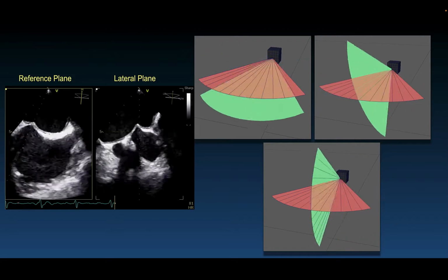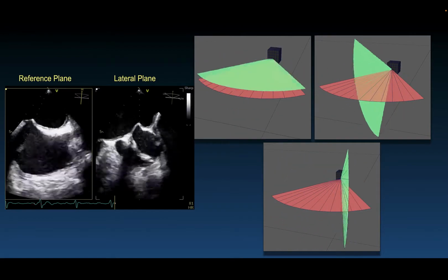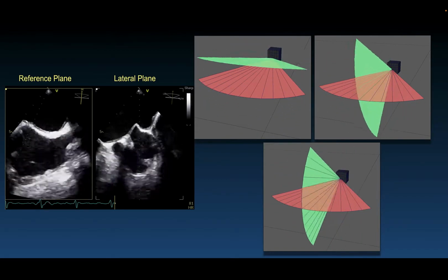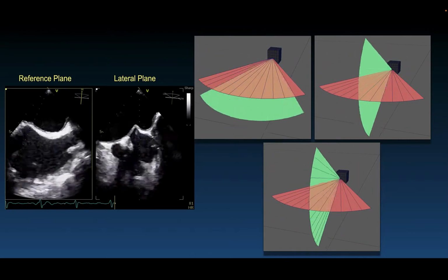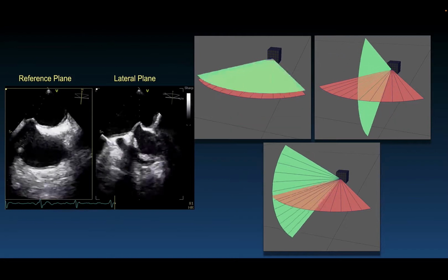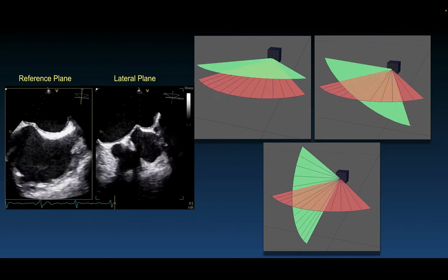And I think personally, it requires a little mental training and spatial orientation to appreciate the translation and the lateral motion of the scan plane to see where we are, because there's no visual feedback on the 3D image of what we are doing. It's purely based on just these two simultaneous 2D images. While these look very good in simulators, when doing an actual 3D case, with the translation and the lateral motion, there's no visual feedback to augment your understanding. So people sometimes get kind of disoriented.